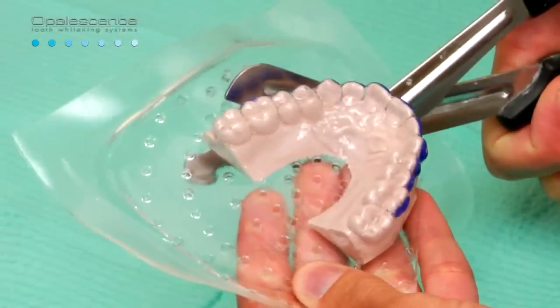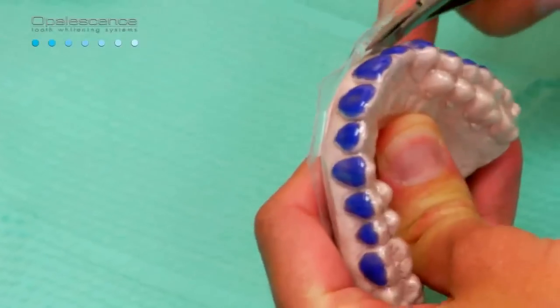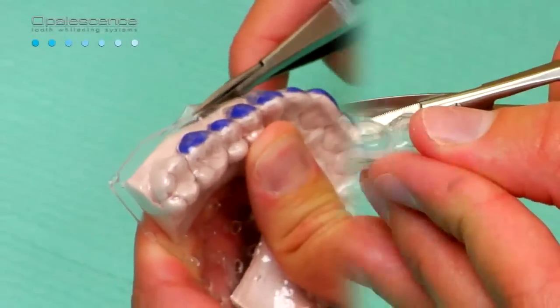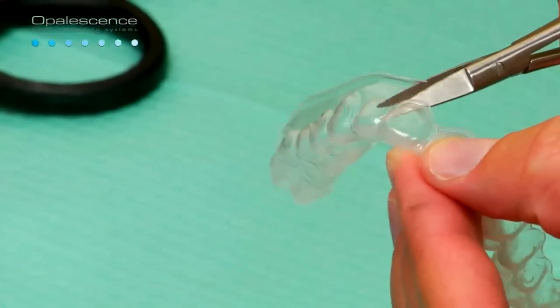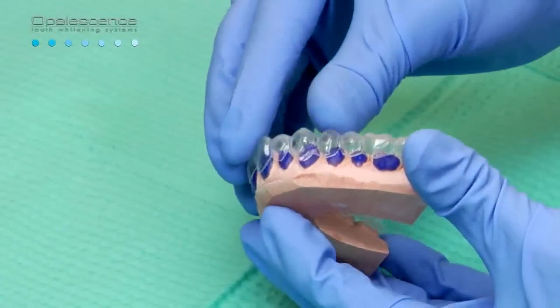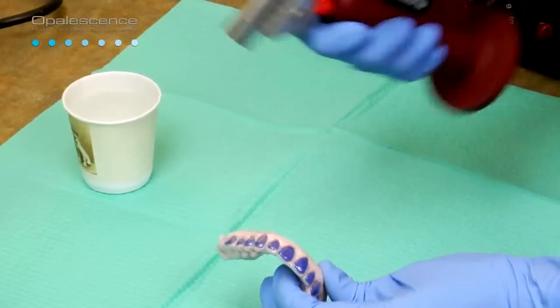Cut the excess bulk of material away with Ultradent Utility vinyl cutters. Use ultra trim scalloping scissors to carefully scallop the tray just shy of the gingival margin by about one quarter to one half of a millimeter. Scallop the gingival embrasures to prevent covering the gingival papilla with the tray. The papilla may become sore and irritated if the tray covers them. Return the tray to the model. Check all tray extensions. Gently flame polish the edges, one quadrant at a time.